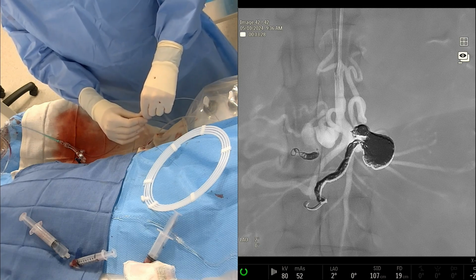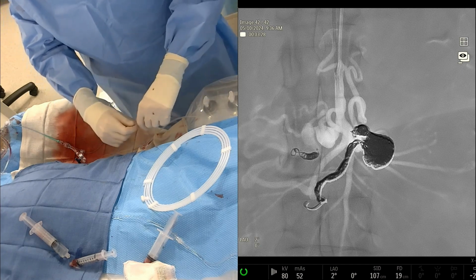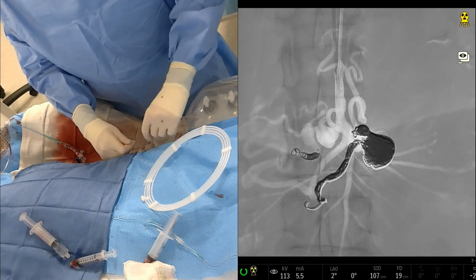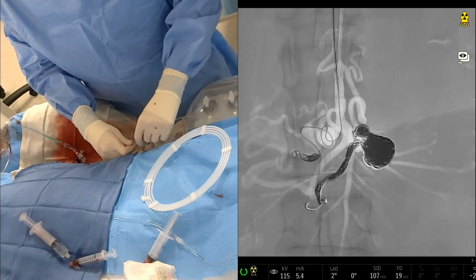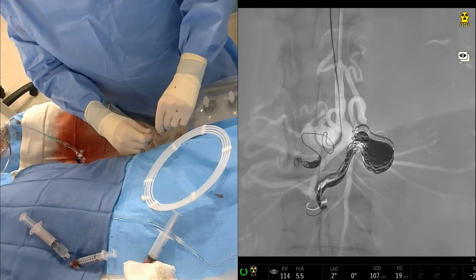You might appreciate it here as you're in that more distal aneurysm. You might want to do a contrast injection to make sure you're okay before you buckle into the first one. And in terms of PSI, the Direction is 1200 PSI, whereas the TrueSelect is 800 PSI.